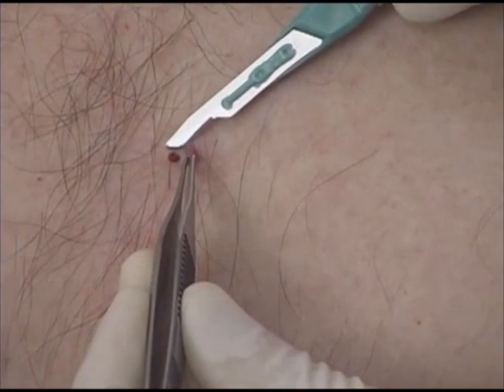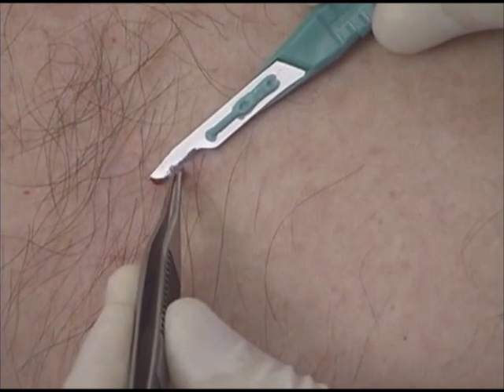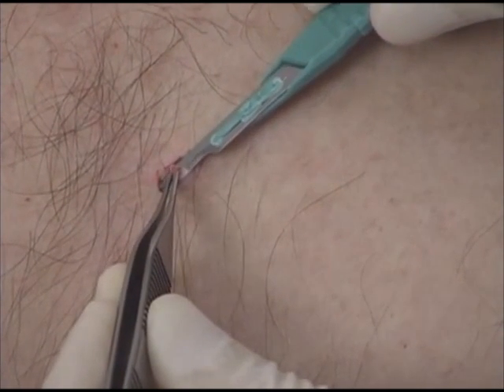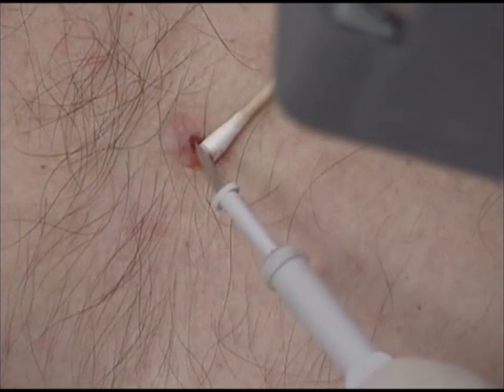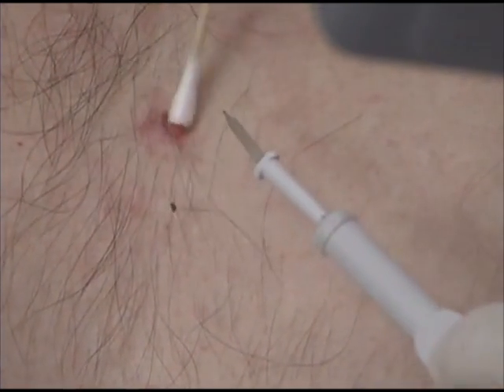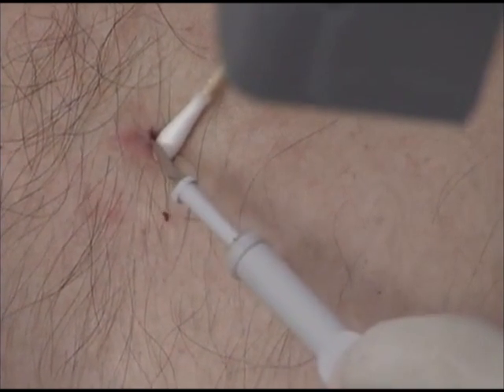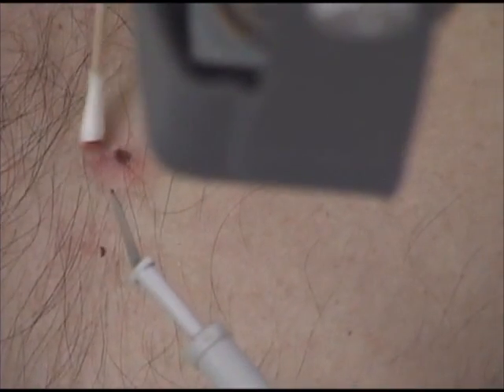I am cutting straight across the lesion with a number 15 blade scalpel using a gentle sawing motion, using the center of the scalpel as opposed to the tip. This gives better control of the shave biopsy — the middle of the blade is sharp and easier to control. The hyfercator is now used to destroy any remaining vascular tissue and produce hemostasis. As I roll the cotton tip applicator down across the lesion, the pressure produces hemostasis and a dry field so that electrocoagulation is more effective. It is very difficult to electrocoagulate a pool of blood. If there is insufficient power, you can use the controls on the handle or the electrosurgical device to turn up the power until adequate electrocoagulation is achieved.